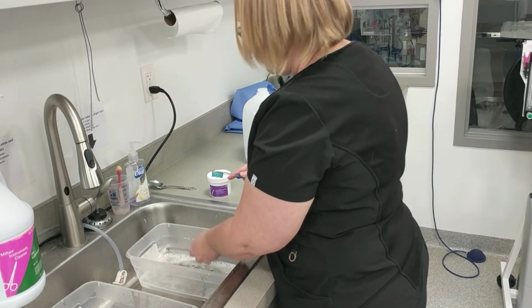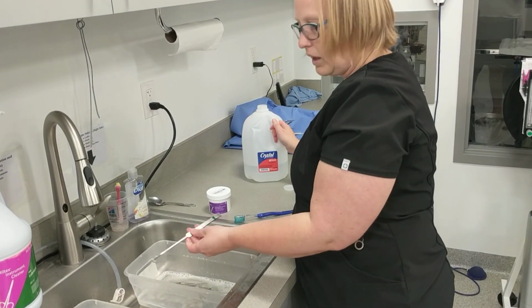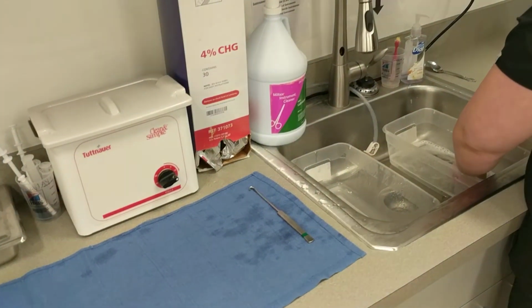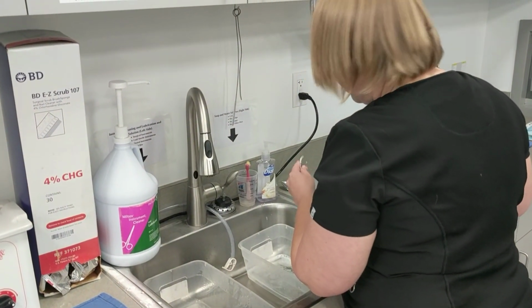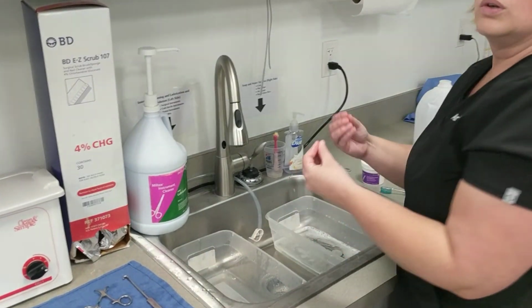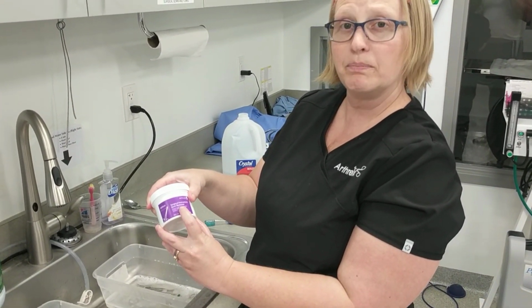And from here, these just came out of there. So after I've done that, I'm going to set them to the side. I'm just going to check them, make sure everything looks clean and detailed. If I notice any possible rust spots, any dark spots, things that don't look like they're necessarily dirty, but they are kind of corroding onto the metal, I like to use the stain remover.